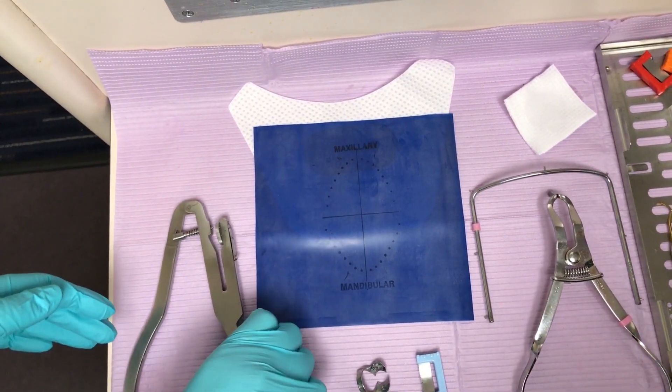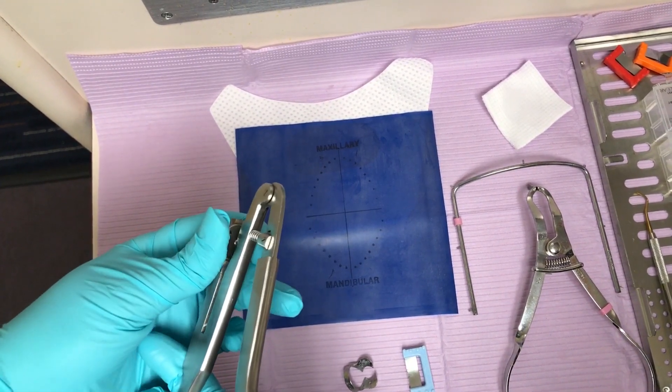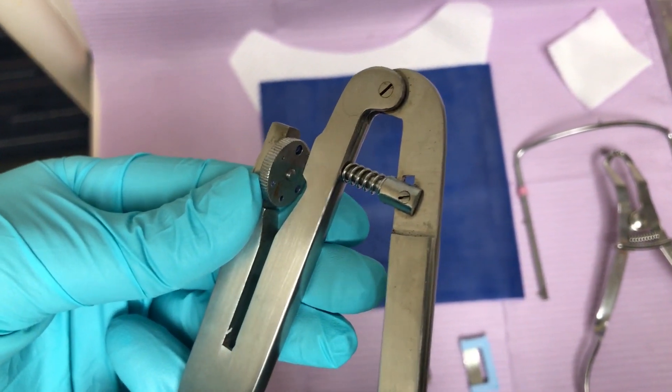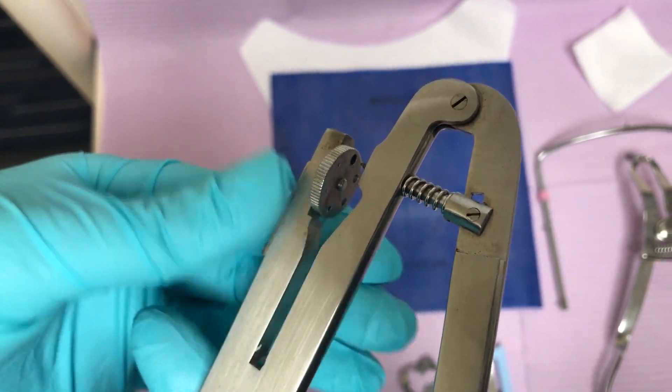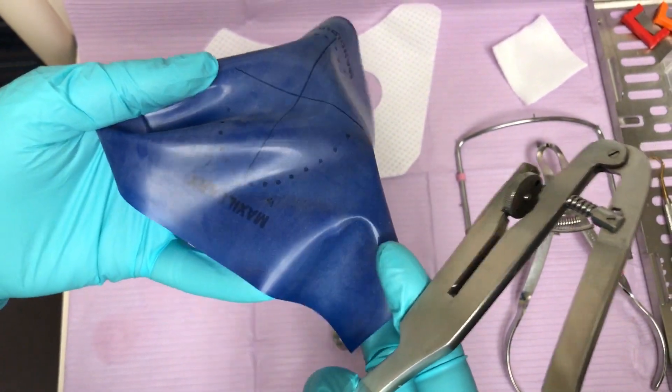After the patient has been seated and anesthetized, the rubber dam process starts. With all of our supplies nearby, I begin by punching the holes in my rubber dam. We are working on number 14 (the 2-6), fixing a broken cusp, so this dam will be a quadrant dam.